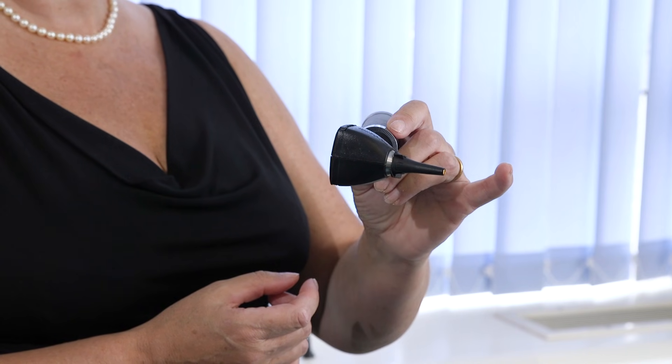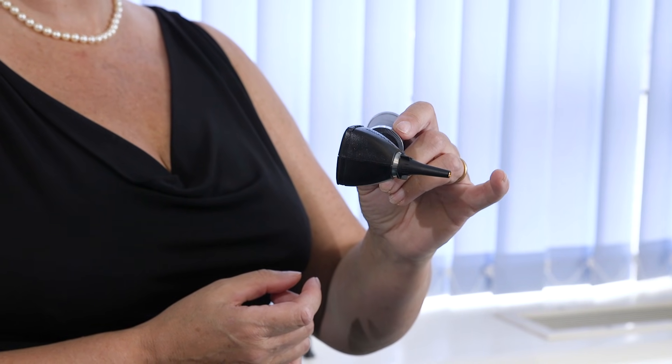Once you've finished examining the right ear you will then move on to examine the left ear. Again you go through the same process for examining the external ear and then the ear canal. To do that you use your left hand and hold it as before, like a pen with the little finger protruding.